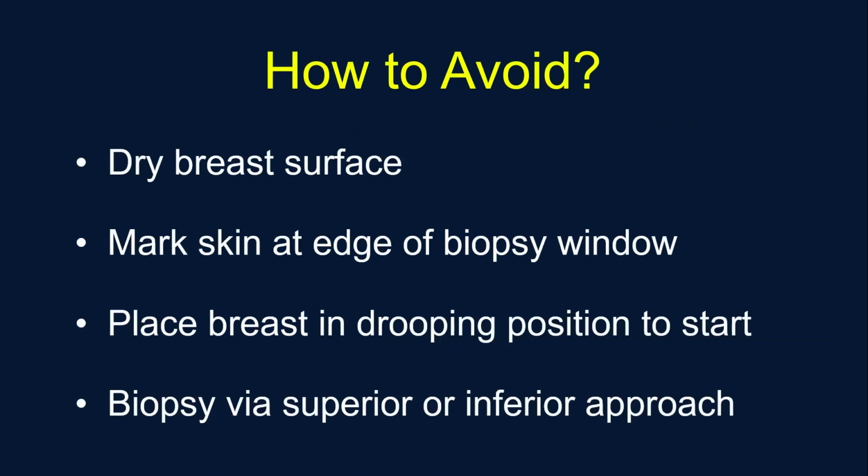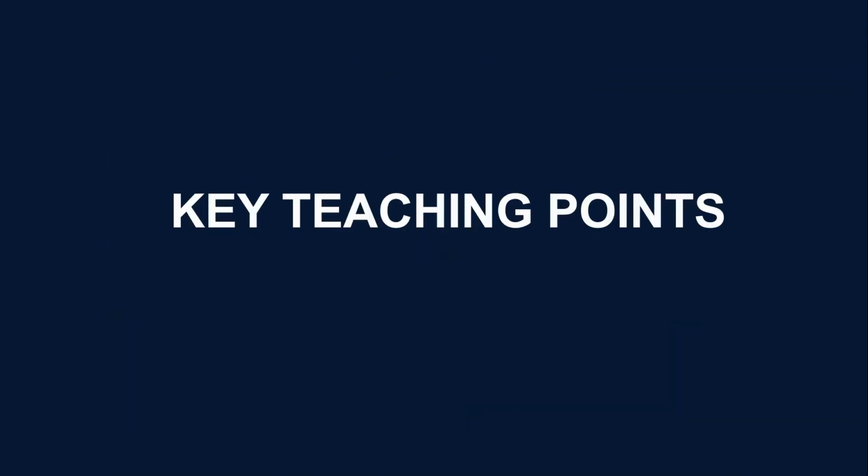So to avoid it, you should dry the breast surface before you position the breast. You should mark the skin edge so you can readily recognize when the breast has dropped. You should place the breast in a drooping position to start with, because that's the most stable position. Or, when all else fails, you can biopsy it using a superior or inferior approach.